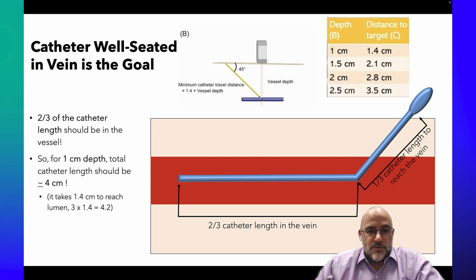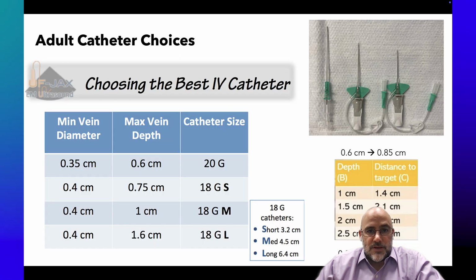Now, obviously, we don't always use a catheter that long for that depth of vessel, but this brings into mind the idea that we need to be thinking about using the longer catheter lengths for our vessels. Here we've done a little bit of that math for you. We can see that on the basis of vessel size and vessel depth, various catheters are recommended.